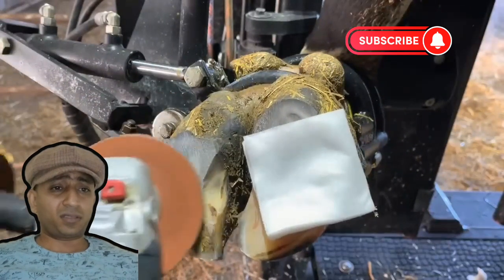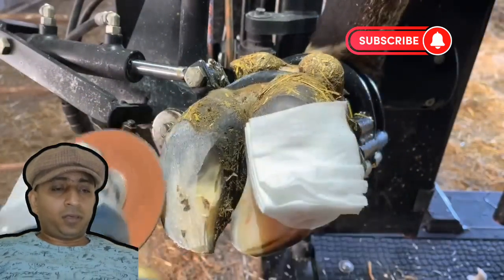Next step here is I use this abrasive disc just to rough that sole up a little bit. It helps with glue adhesion.